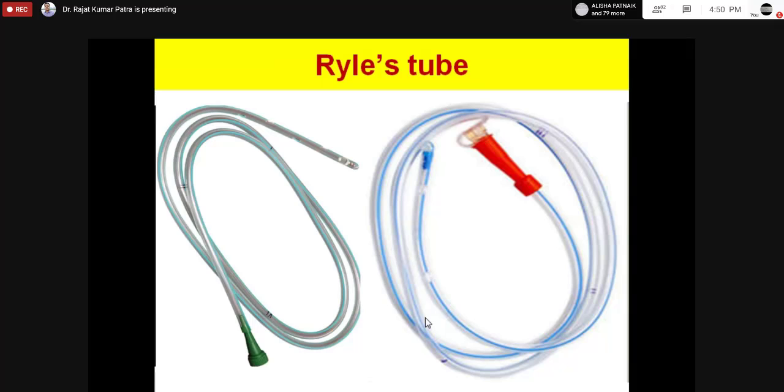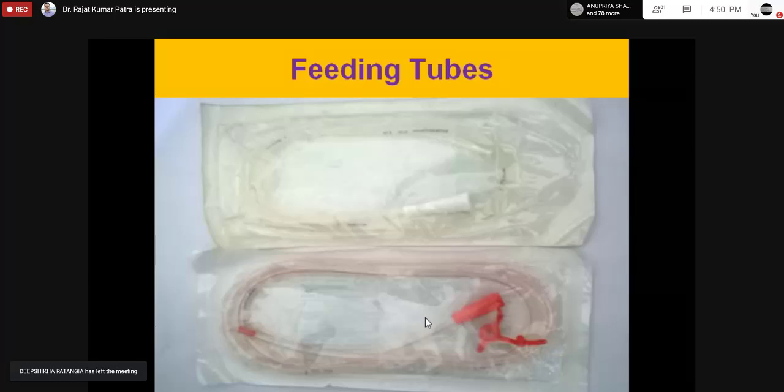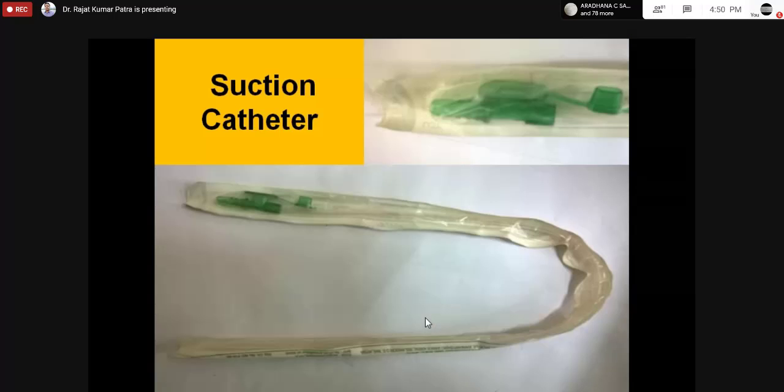So from that color, sometimes people may ask, what is the number of this? What is the number of the green color? Why? Because these are used in emergency, okay. So by seeing this color you can say what the number is. That's why there are different colors. You get black, green, white, red, okay.